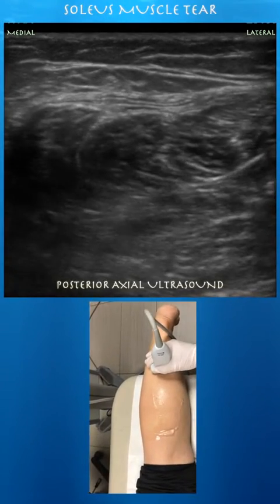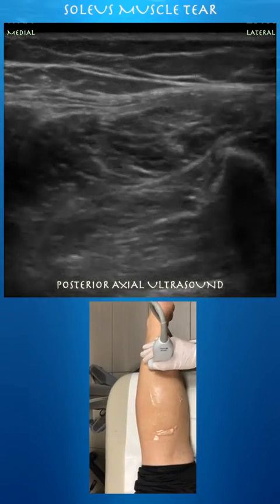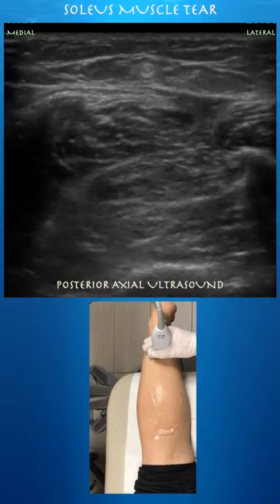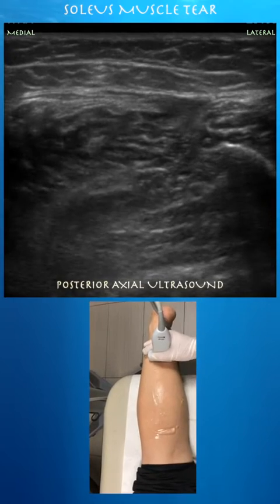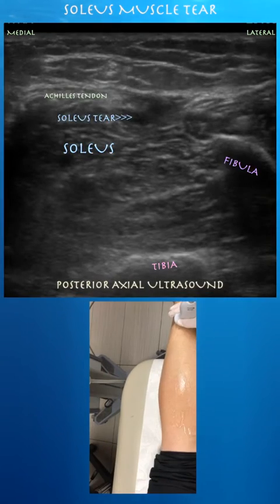This is kind of where she's mostly tender — the Achilles tendon. Not seeing anything overly concerning, maybe just a little bit on the lateral side here. You can see in the distal lateral soleus muscle this black anechoic signal consistent with a small tear of the muscle.